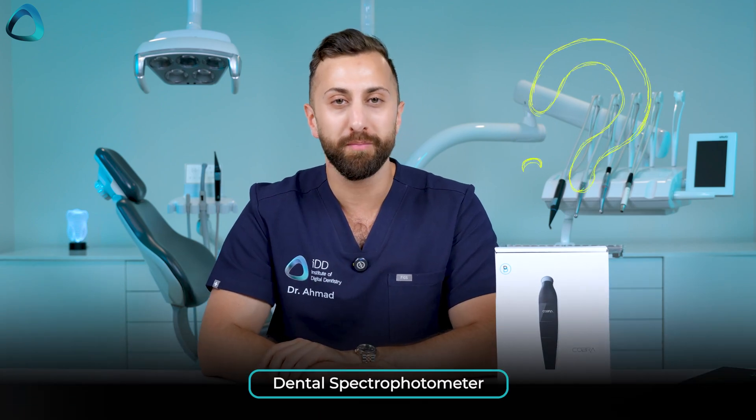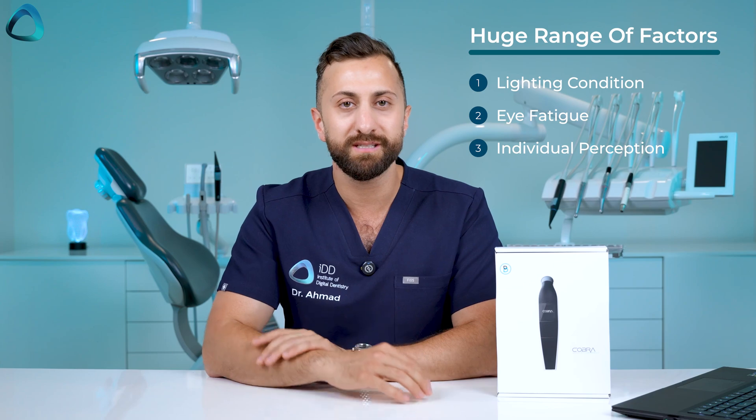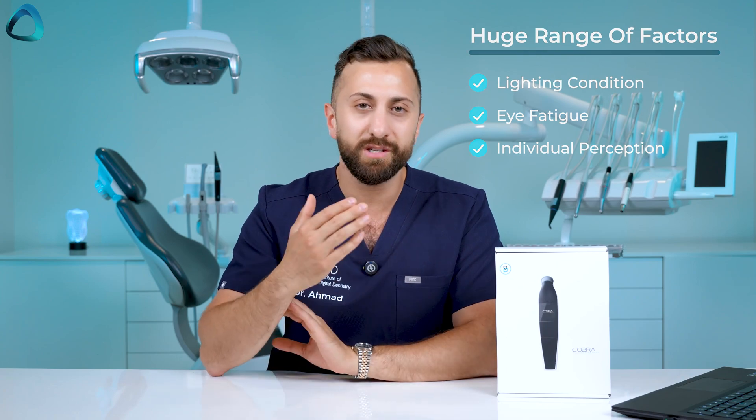Before we get into today's unboxing, let me quickly explain what a dental spectrophotometer is and why it matters. In dentistry, getting the right tooth shade is critical for creating natural-looking restorations, and it's a lot easier said than done. Traditional shade guides rely heavily on the human eye and can be affected by lighting conditions, eye fatigue, and individual perception — making it extremely subjective and prone to errors.